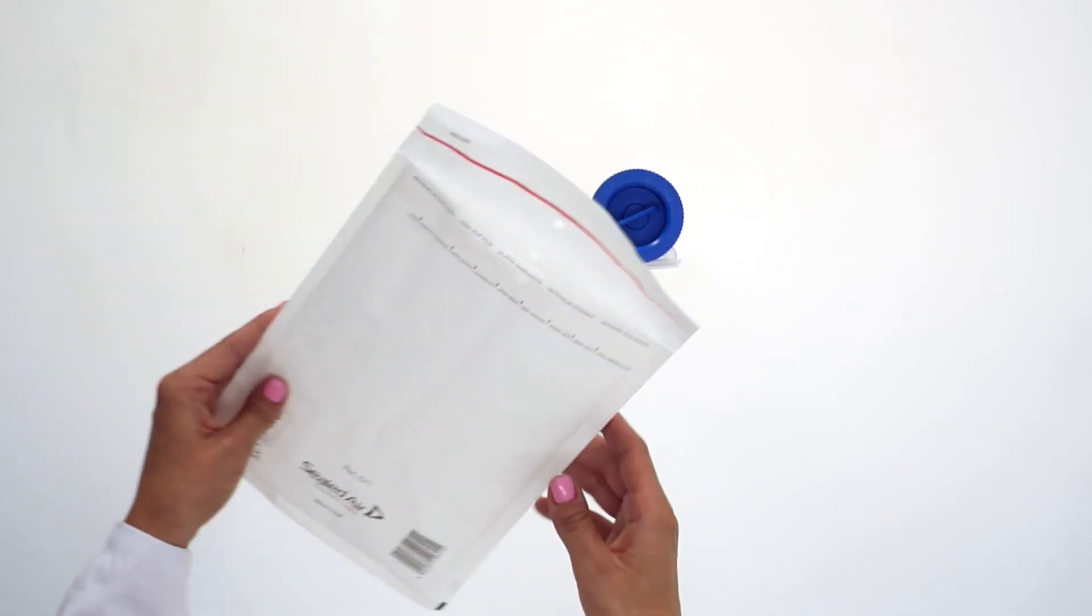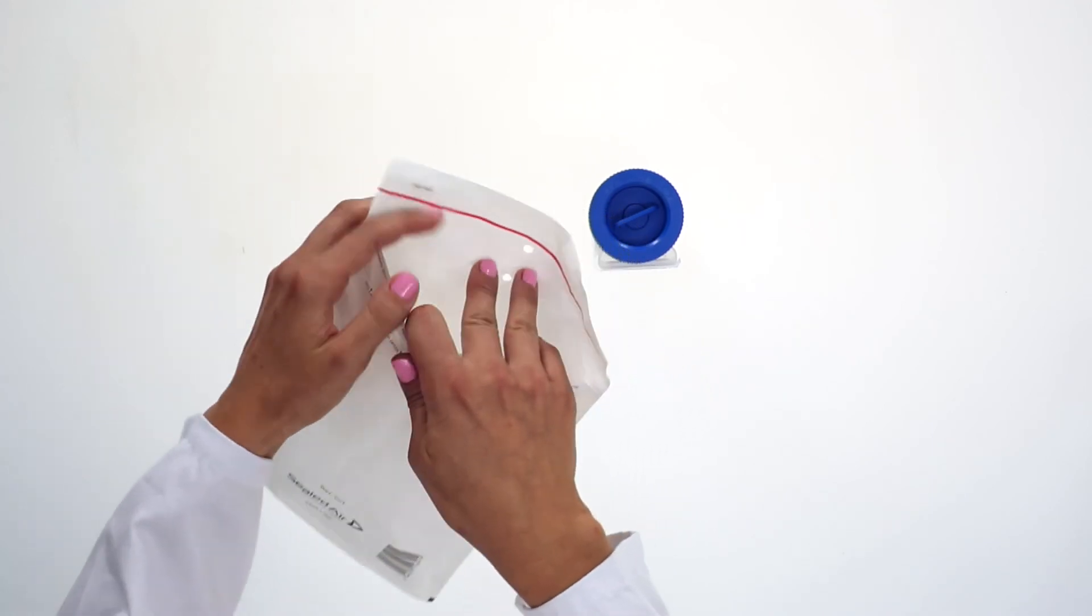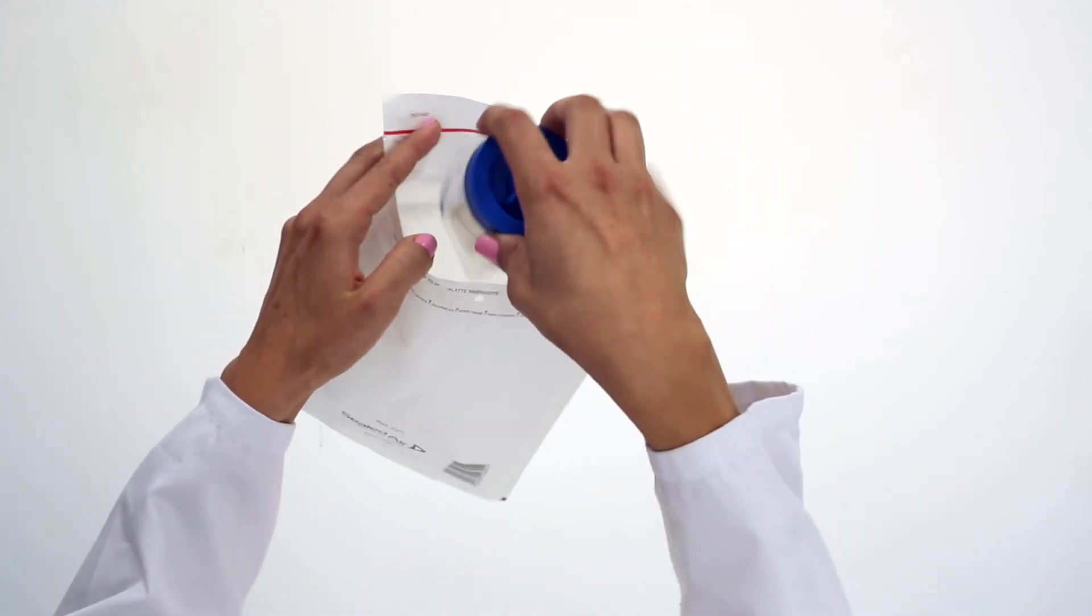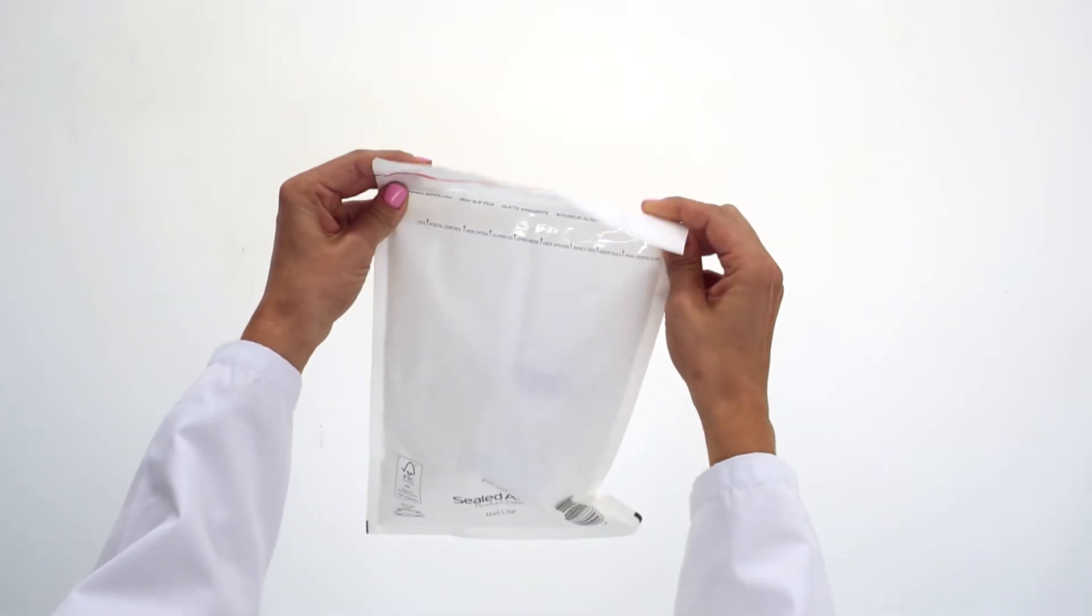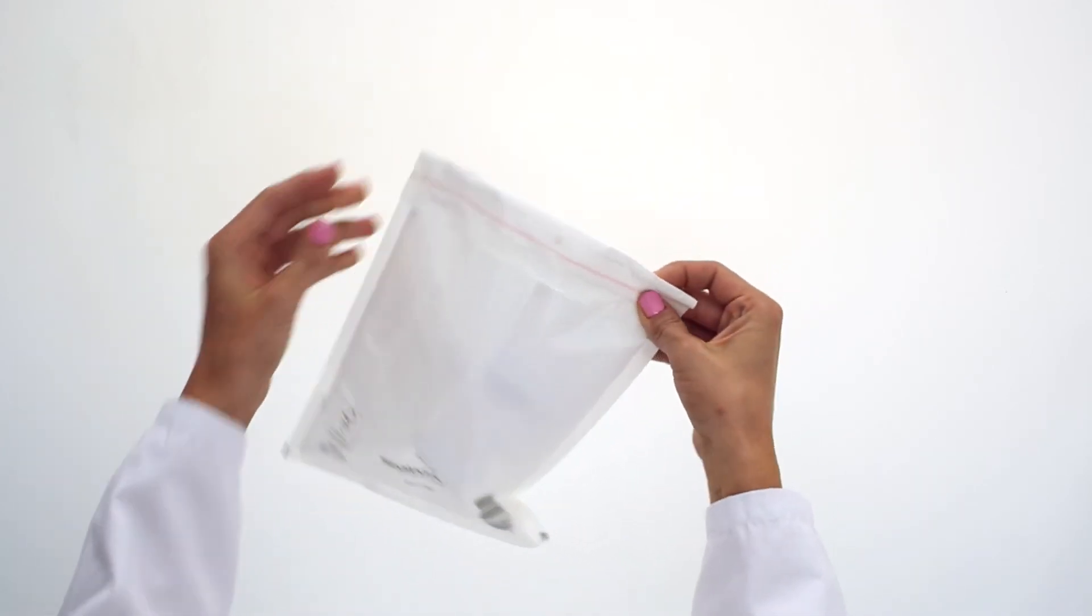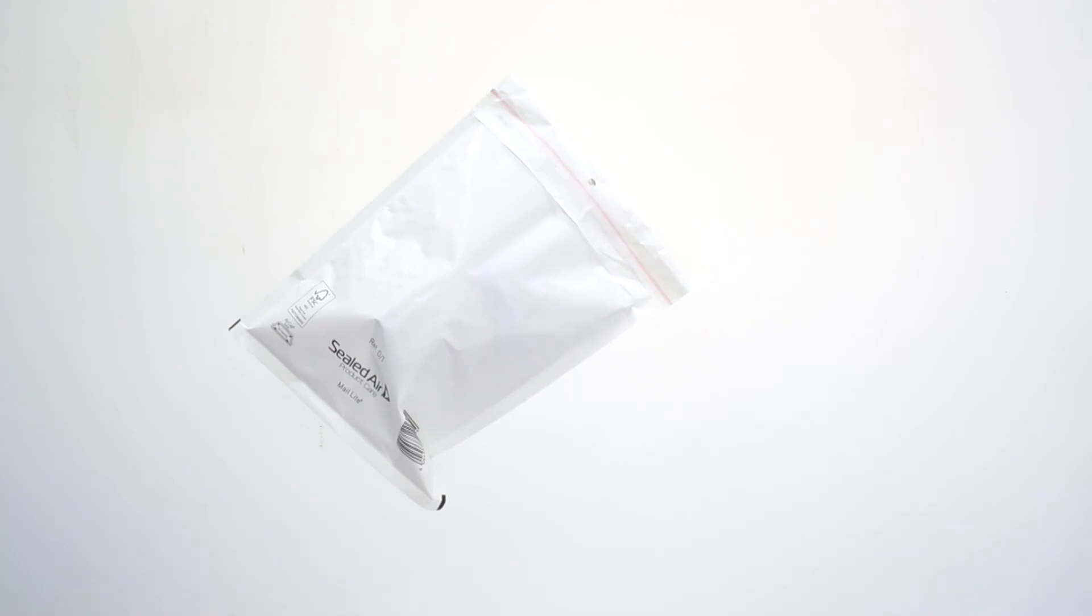In the event of a positive or borderline result, there is no need to pour the urine sample into a new container. You can use the Nahl von Minden drug screen cup itself as a transport container to send the specimen for confirmatory analysis.